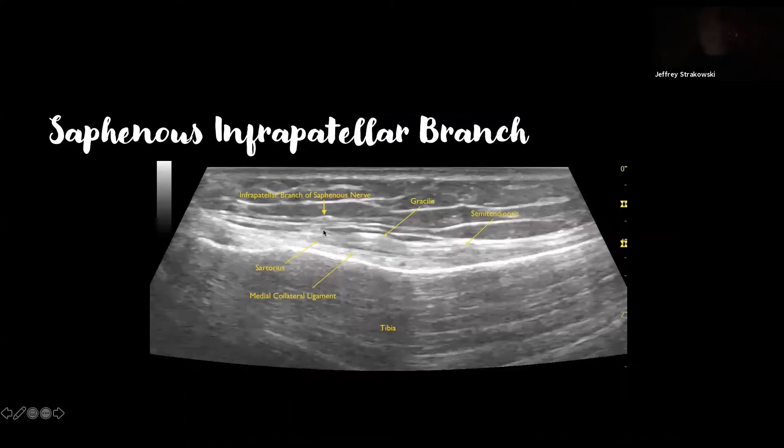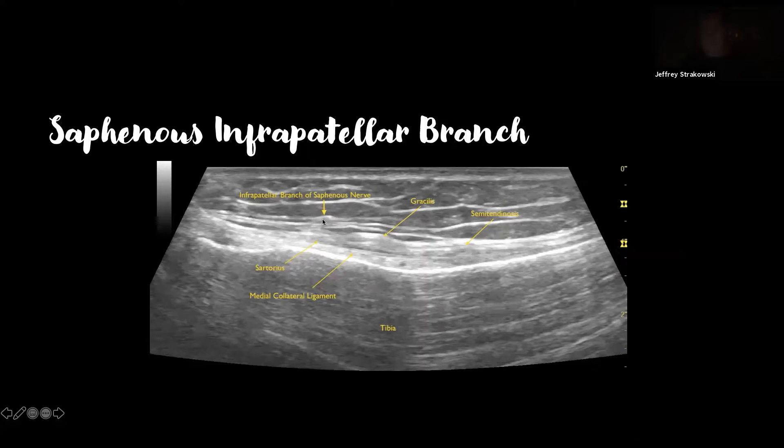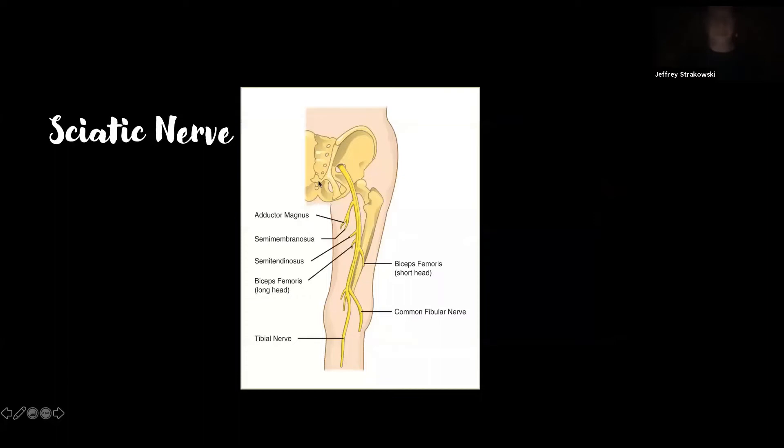The infrapatellar branch is sometimes injured by trauma, knee injuries, knee replacements, or other surgeries. We can see it by conventional ultrasound at the area of the pes anserine — here's the gracilis tendon, semitendinosus tendon, deep part of the medial collateral ligament, the edge of the tibia, and the sartorius. The infrapatellar branch usually rides between the sartorius and gracilis tendons superficially. With ultra-high frequency, we can see every little fascicle of the infrapatellar branch, which is very helpful for identifying an injury pattern and assessing response to intervention.